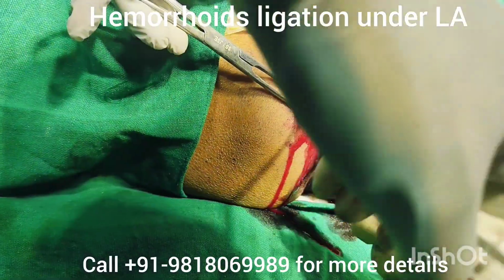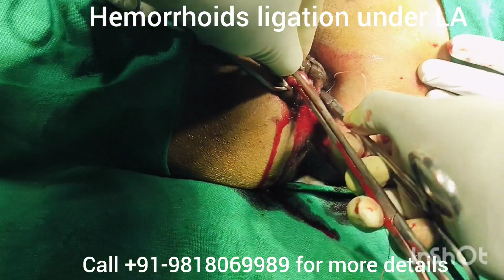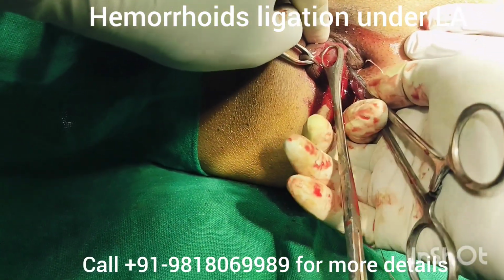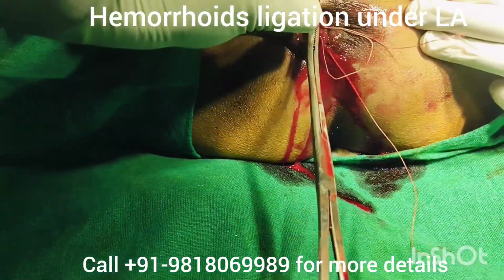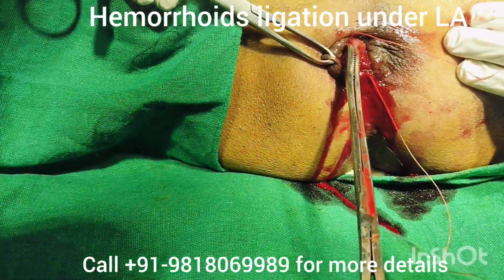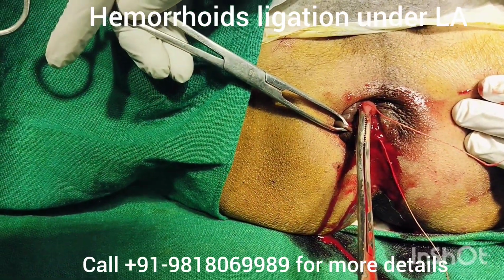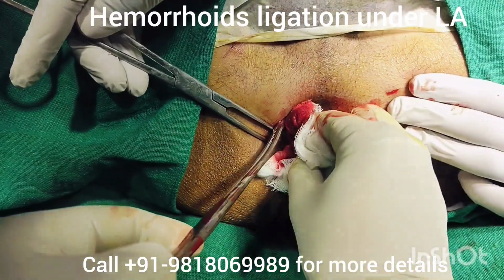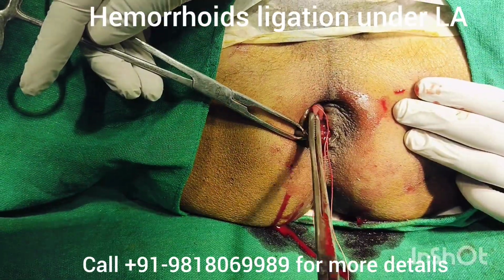Now again pedicle is transfixed at base, and again knot is placed medially. The same steps have been repeated to ligate the pile mass at 11 o'clock position. We can take separate thread too, but in this particular case I have chosen the same thread and transfixed it.